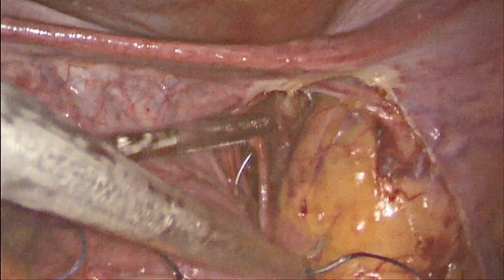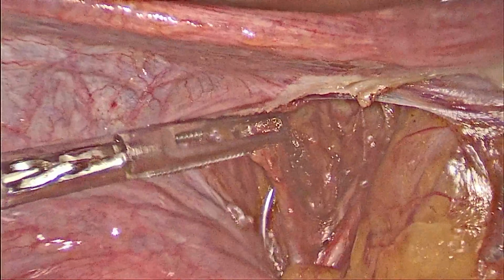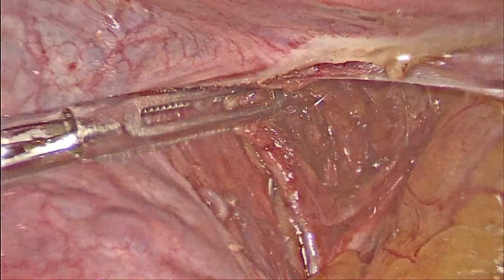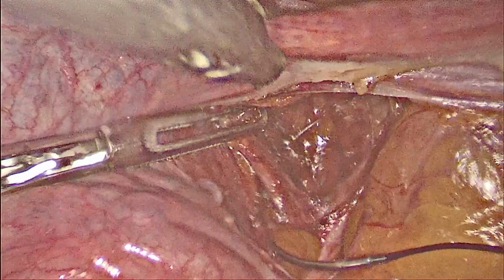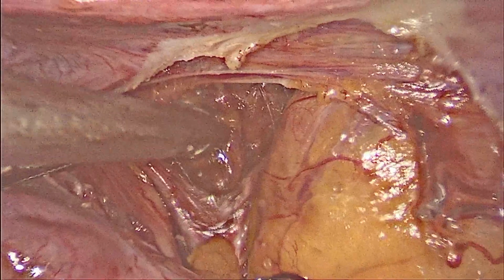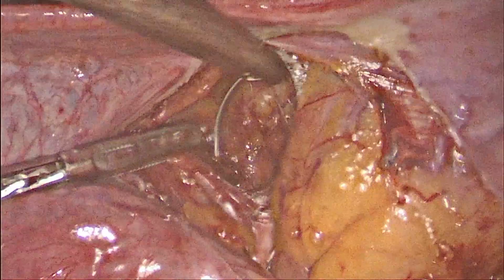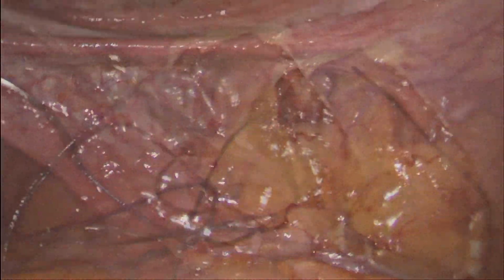So instead of causing an avulsion of the vessels, we thought of taking it through with the needle. But while doing this, extreme caution should be taken that we do not injure any other vessels. The most important vessel, which is very close here, is the external iliac vein. While taking the bite or while taking the needle out of this place, we may injure the external iliac vessel. Care should be taken that we do not injure the external iliac vessel, which will invite more danger.